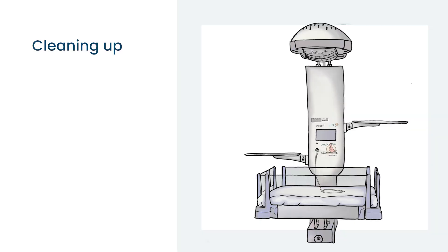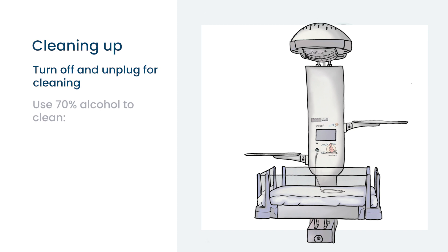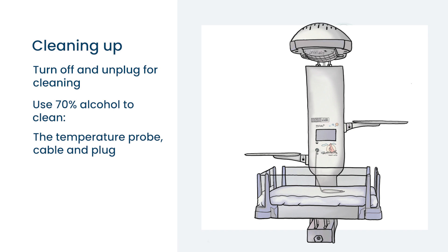Now it is time to clean up. First of all, make sure that you turn off the radiant warmer and unplug it. After every use, you need to clean the temperature probe, including the cable and the plug where it goes into the machine, the control panel, the power buttons, and the cot. Clean the mattress on both sides and the cot walls.